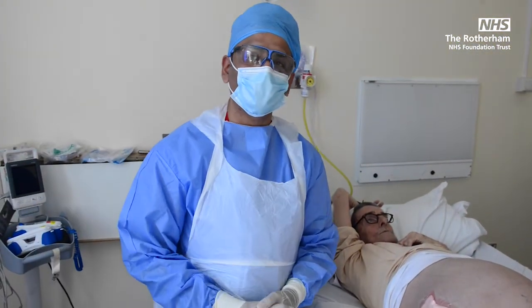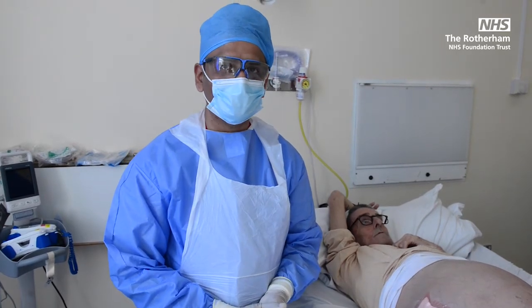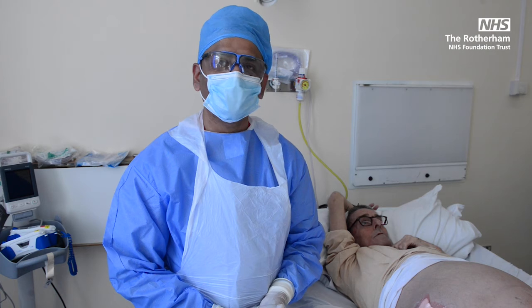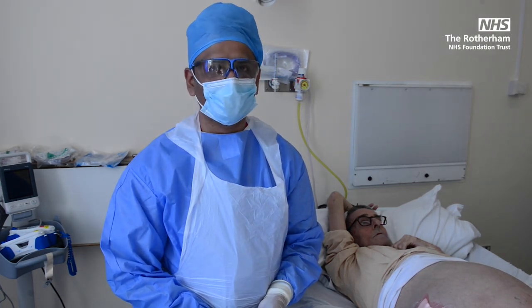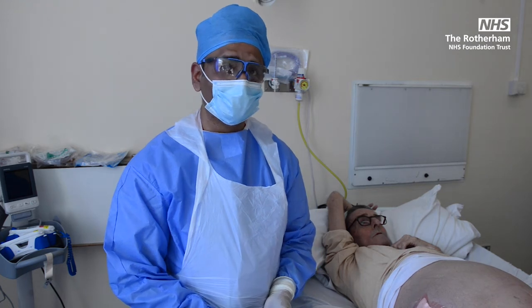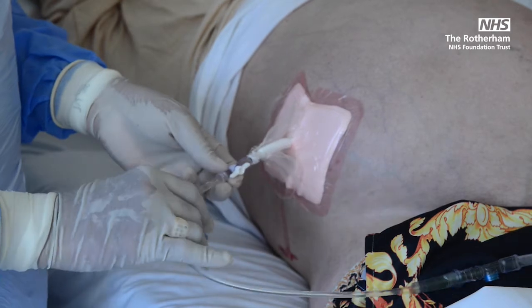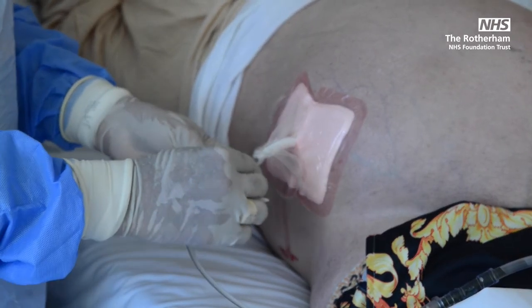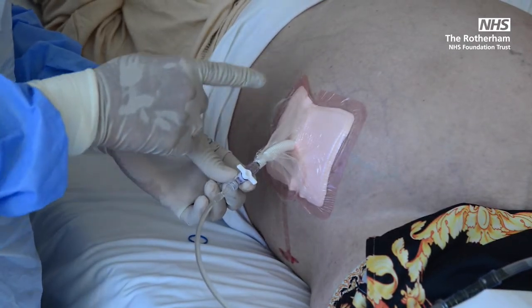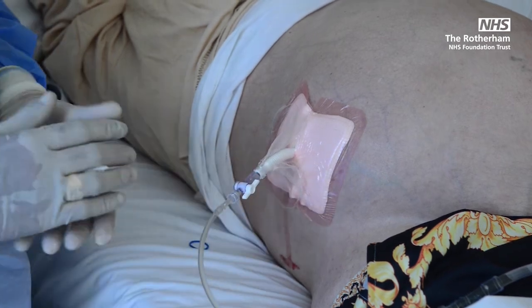Next, we want to make sure that for every 2.5 liters to 3 liters of ascitic fluid that is drained, we give 100 ml of 20% albumin and give it over 15 to 30 minutes. Make sure that for every 3 liters, you give 1 bottle. If the patient becomes hypotensive, make sure that you just close the two-way catheter so it's not draining, and then make sure you give some albumin. I'm going to leave it open for now.